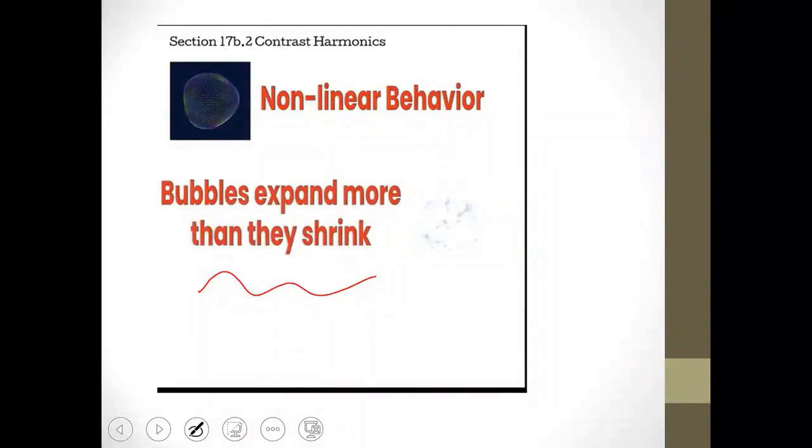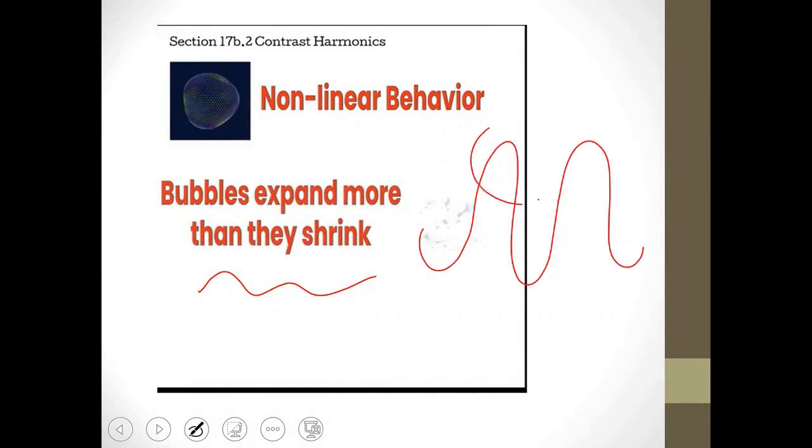The first part of the discussion elaborates in detail on the reasons behind this phenomenon. As we have previously mentioned, there exists a specific segment that exerts pressure or compression, leading to the shrinkage of the microbubbles. This particular segment is responsible for creating the observed effect.